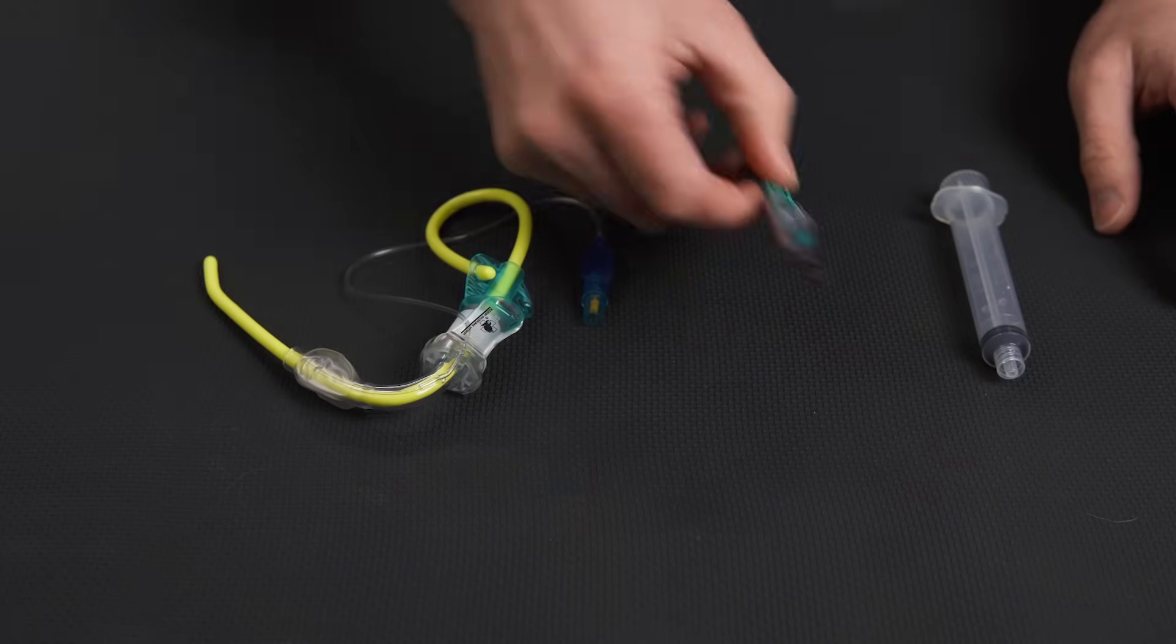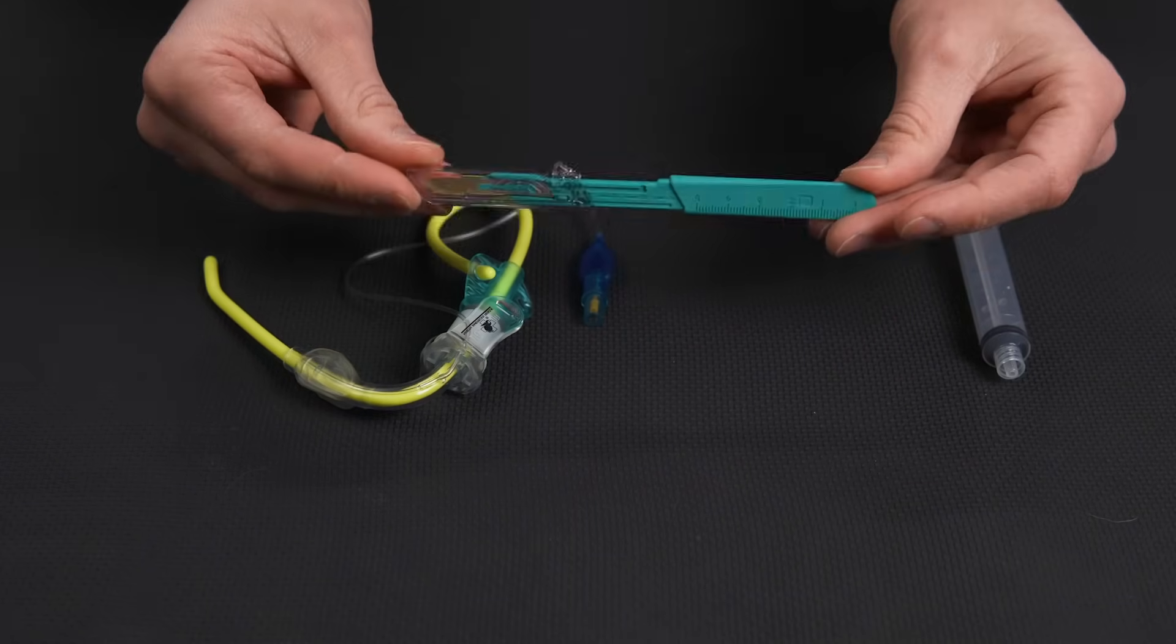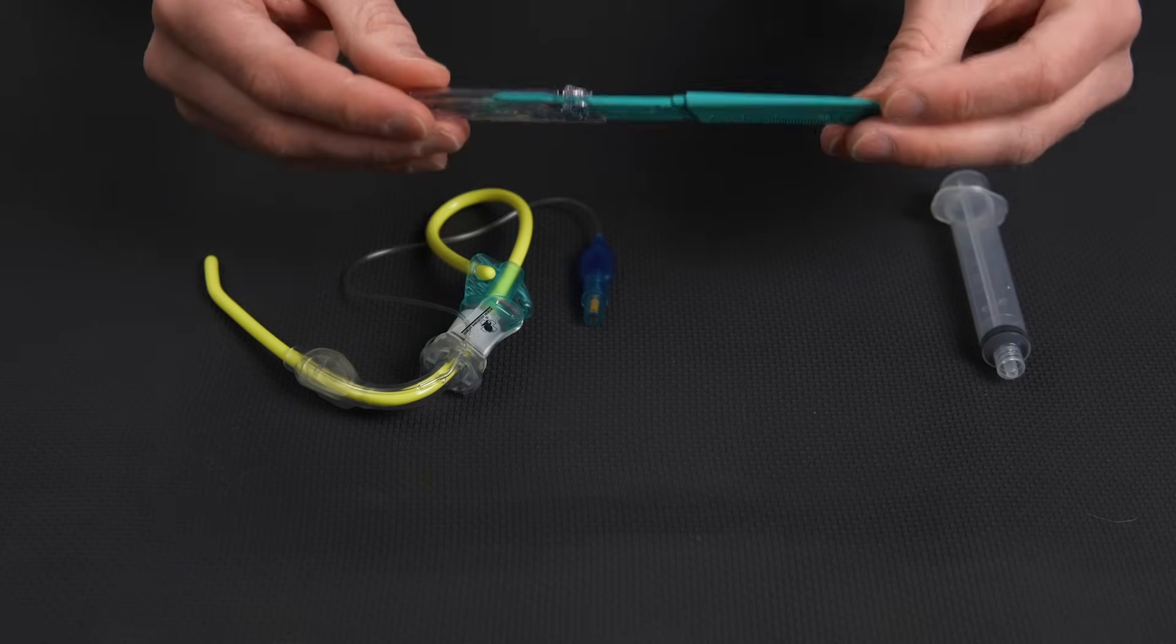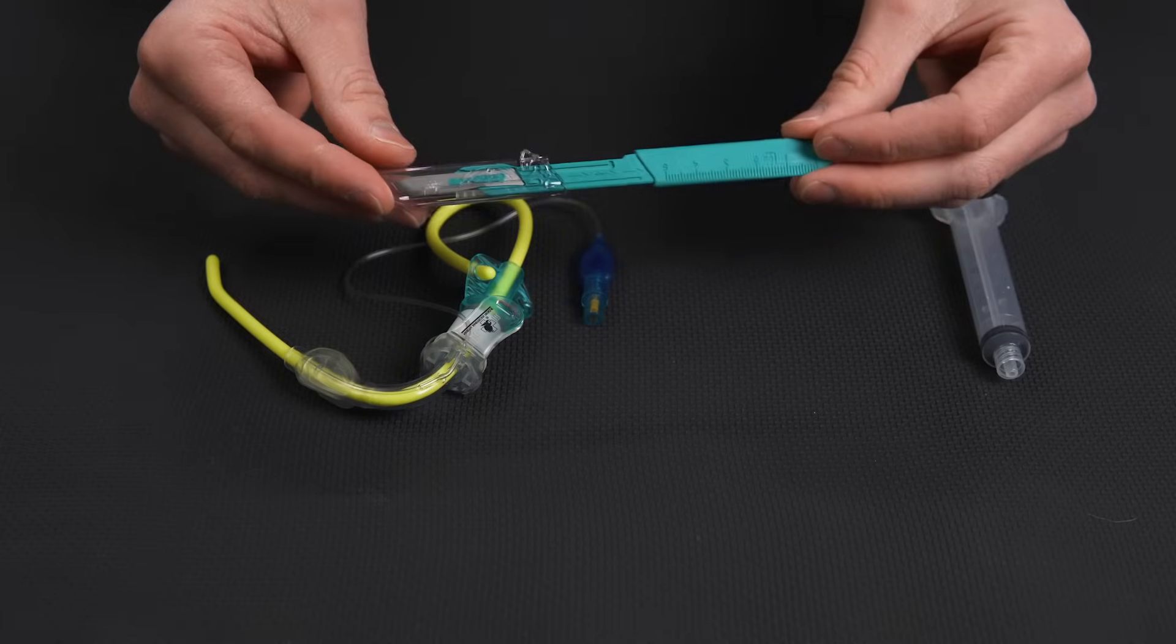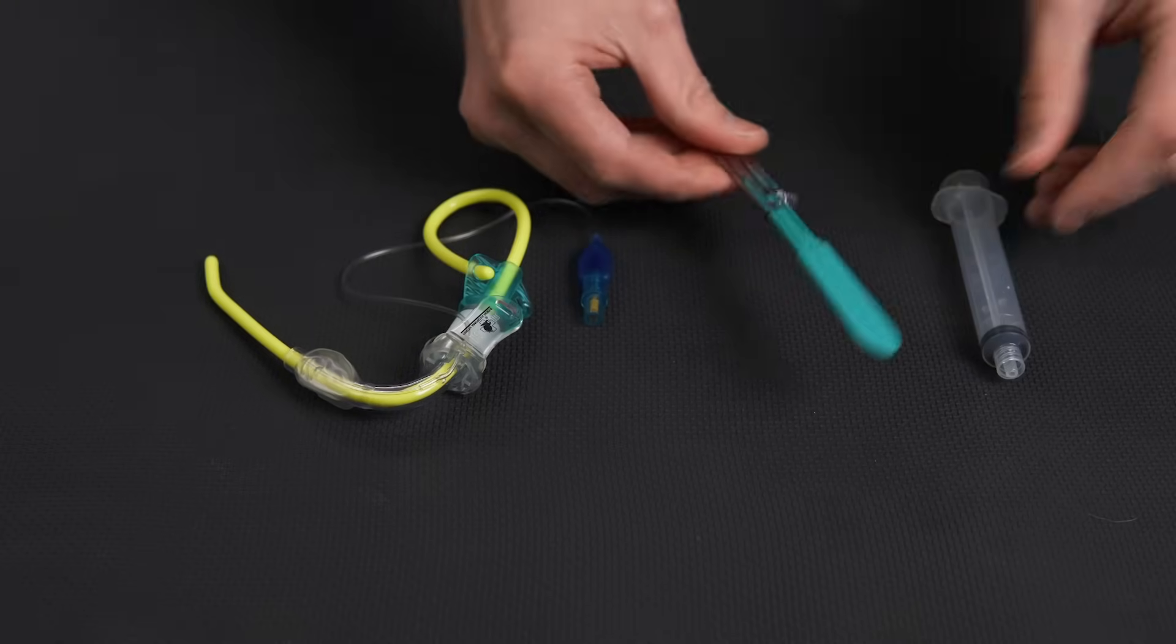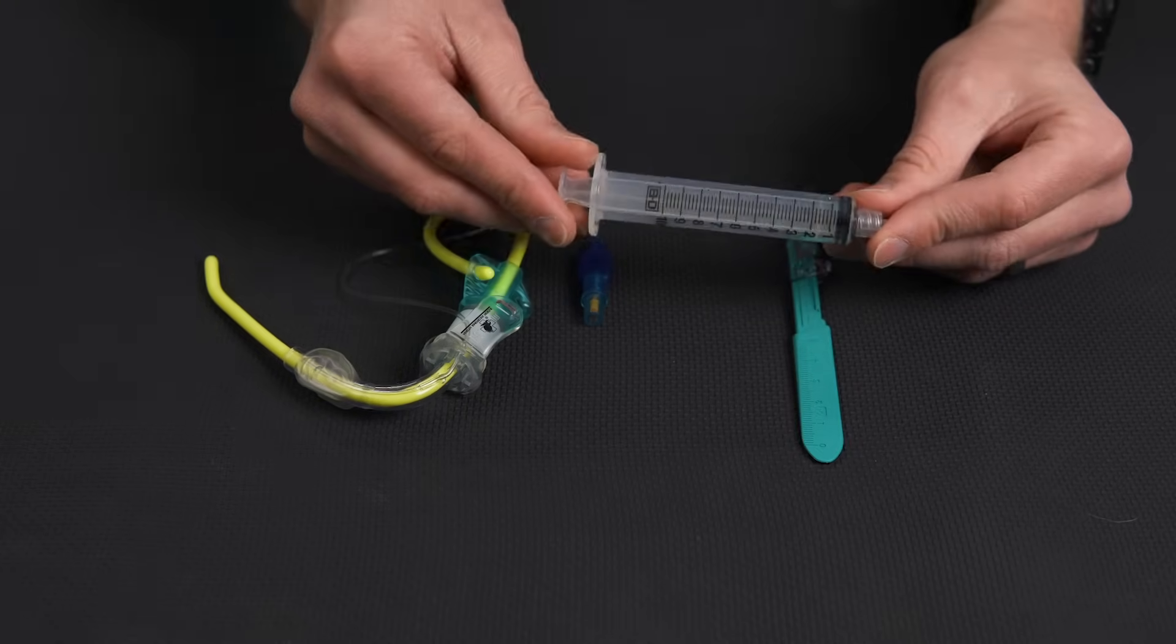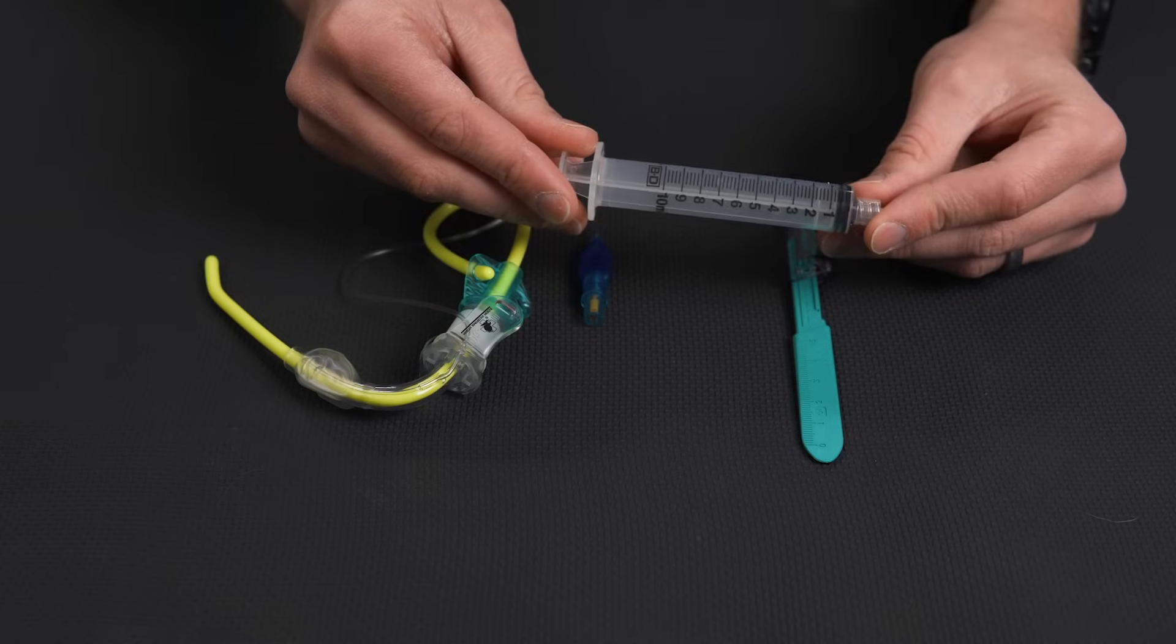You'll need a scalpel. There is some debate on what size scalpel you should use. I use a number 10 scalpel for this. It's what I've been trained on and what I routinely use. And then lastly, you need a 10 ml syringe to perform it.